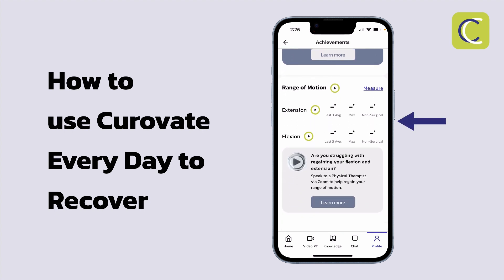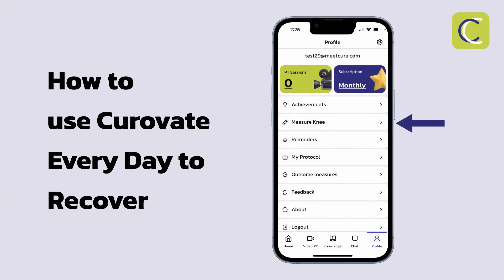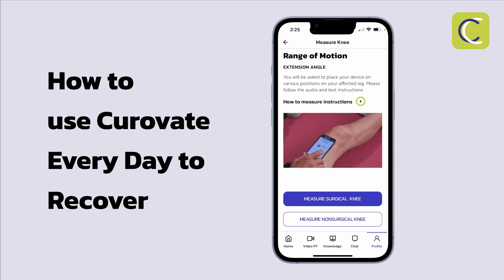If you scroll down you'll see the range of motion section, which is currently blank but will show graphs for your knee or hip bending and straightening. To measure that, go to profile and select measure knee. We have a separate video both on our blog and in the app that shows you exactly how to measure your knee and hip range of motion.